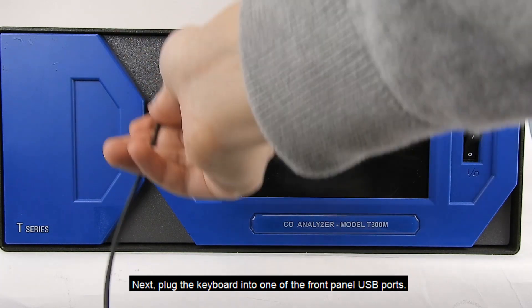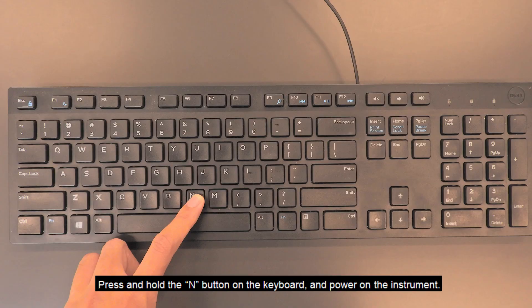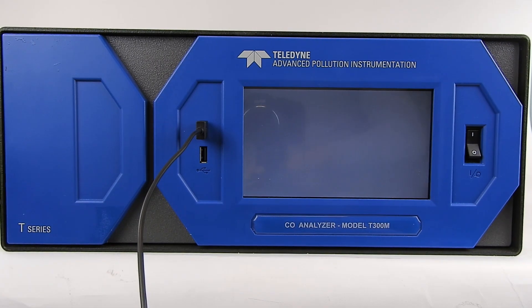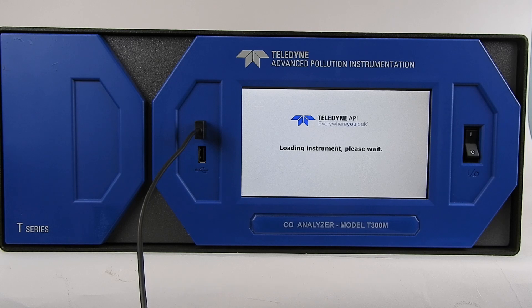Next, plug the keyboard into one of the front panel USB ports. Press and hold the IN button on the keyboard and power on the instrument. Continue holding the IN key until the screen is displayed. You have successfully switched to NumaView software.